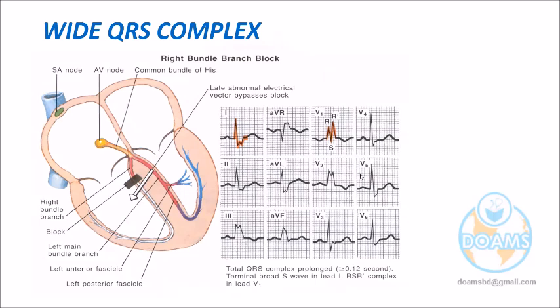But if you want to say specifically right and left, to differentiate we have to see the precordial leads, easy to understand. V1 up to V6. So V1 is left or right? Who can say, Dr. Mahfouz? Right. So what we are looking at here in the right is the QRS complex pattern, RSR pattern.